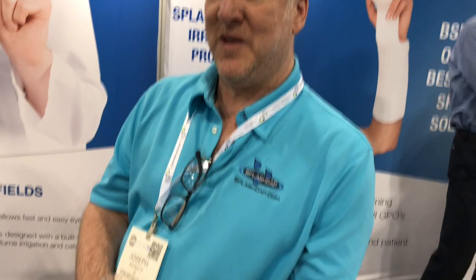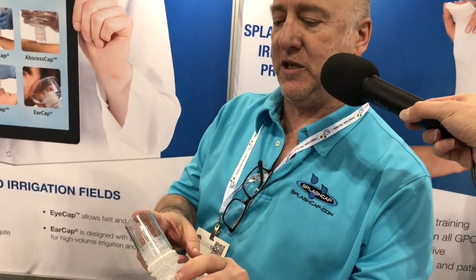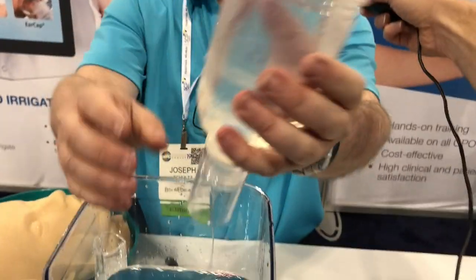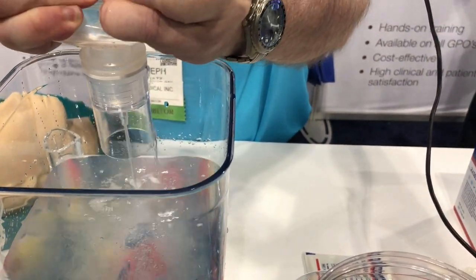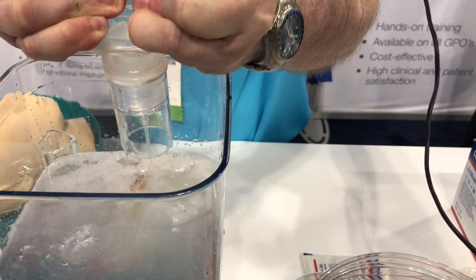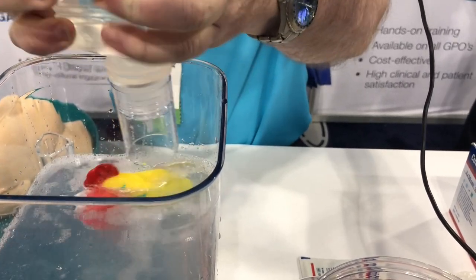So, wound irrigation first — we've got the splash cap, which has a built-in nozzle and a built-in shield, so it allows you to do high-volume irrigation with both pressure and volume. You can see that I'm generating a lot of pressure — that's knocking the fish all the way down, keeping them down, and high-volume.